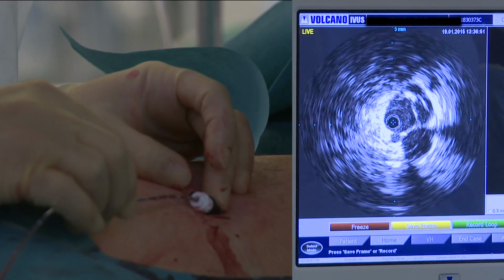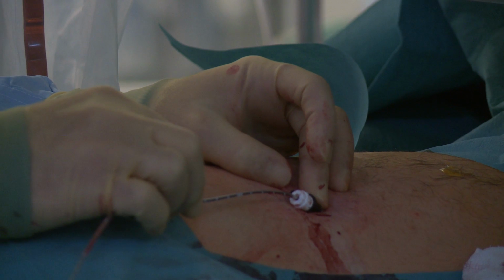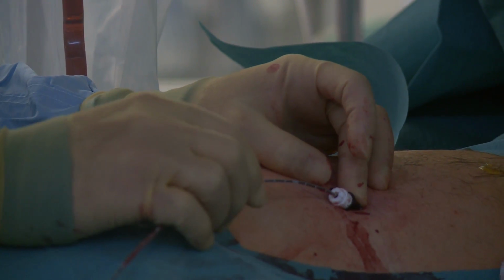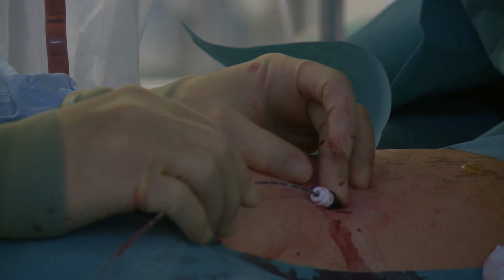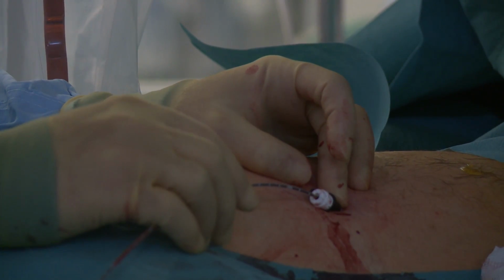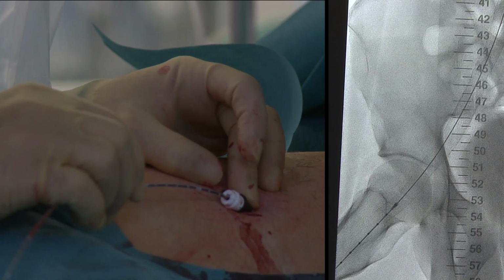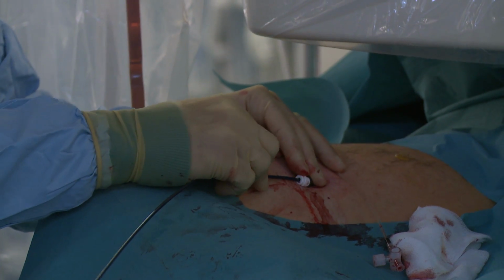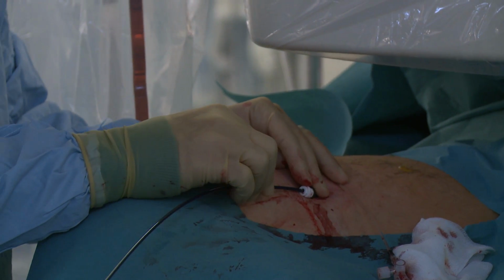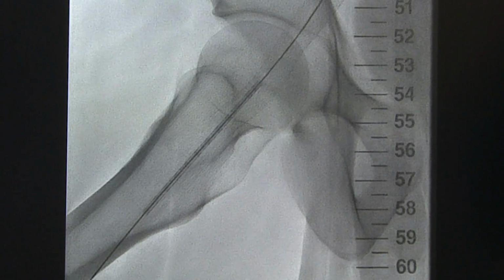1, 2, 3, 4, 5. In this case, at 5 centimetres, we are now inside the stent with just over 1 centimetre of overlap. There should be a minimum of 1 centimetre overlap, which would result in the need for a 60mm stent.